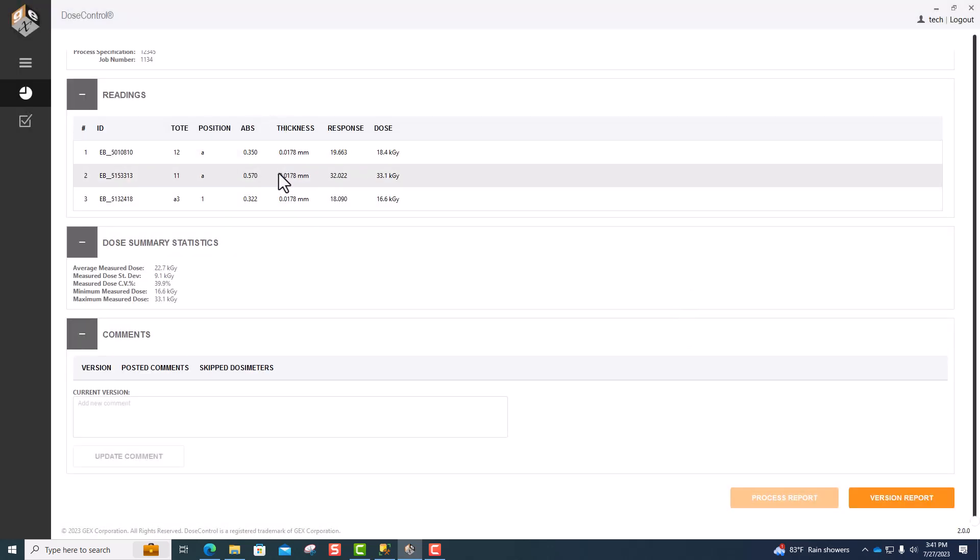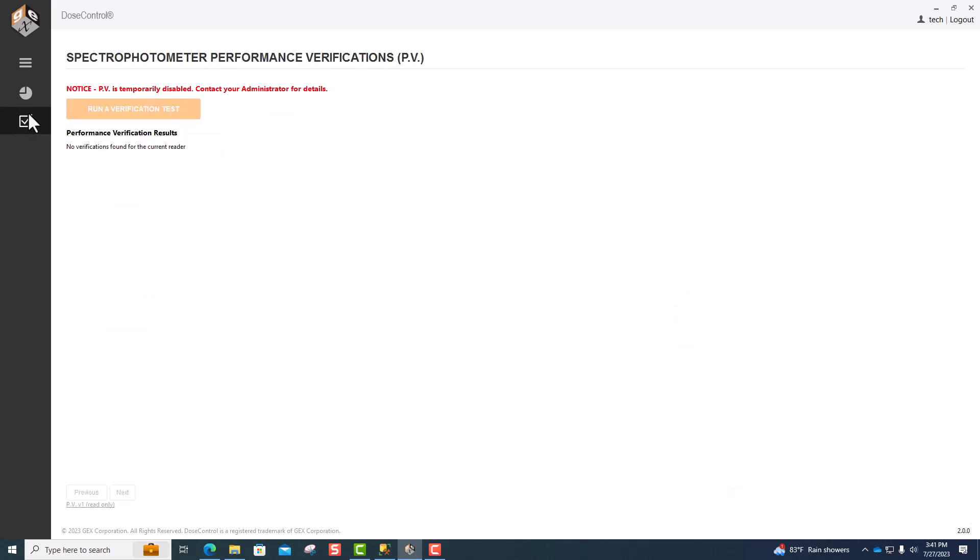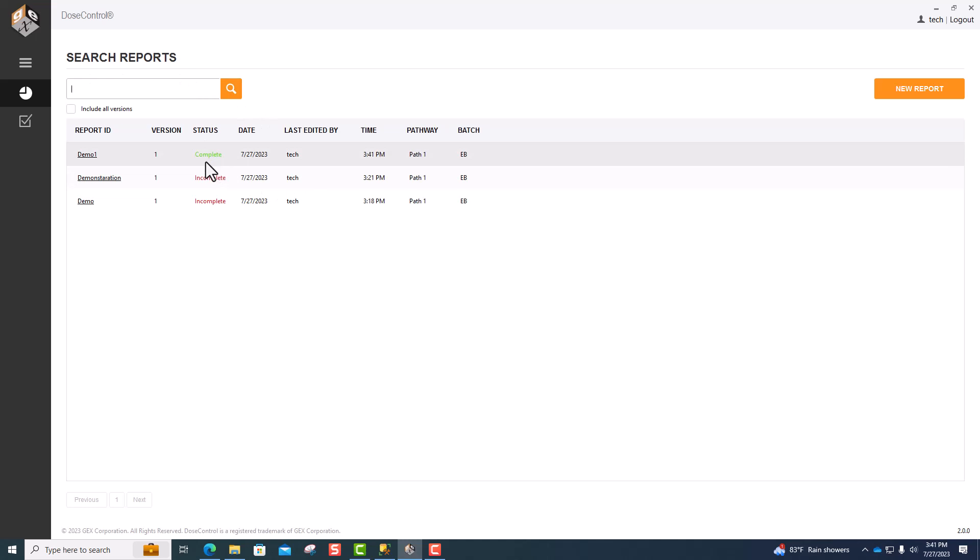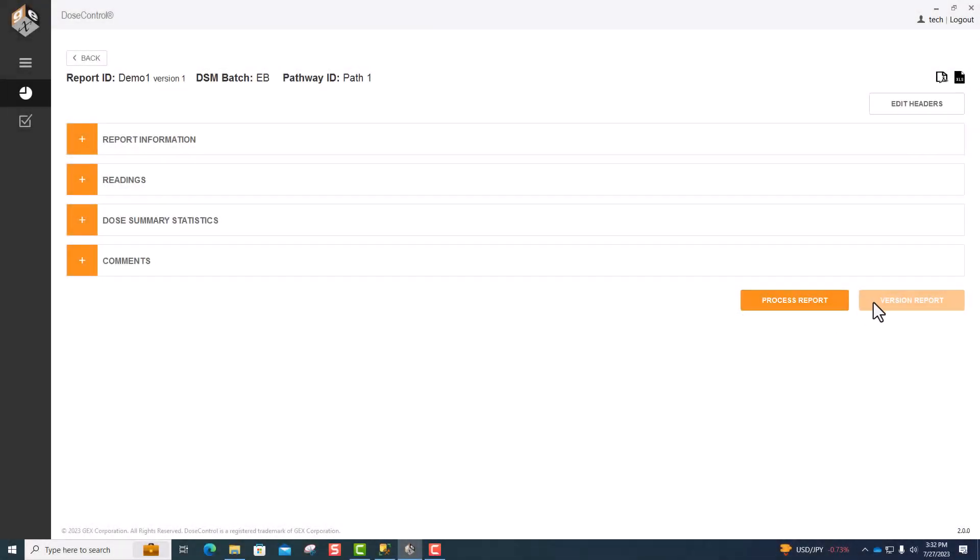Once the report has been processed, in the report screen, it shows a complete status in green, compared to an incomplete, unprocessed report in red. You can process the report and print the report from this page in PDF and Excel.